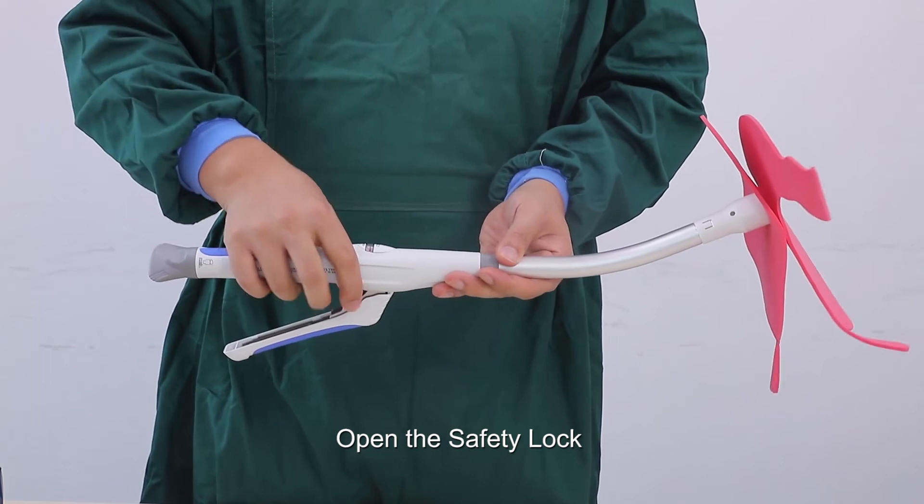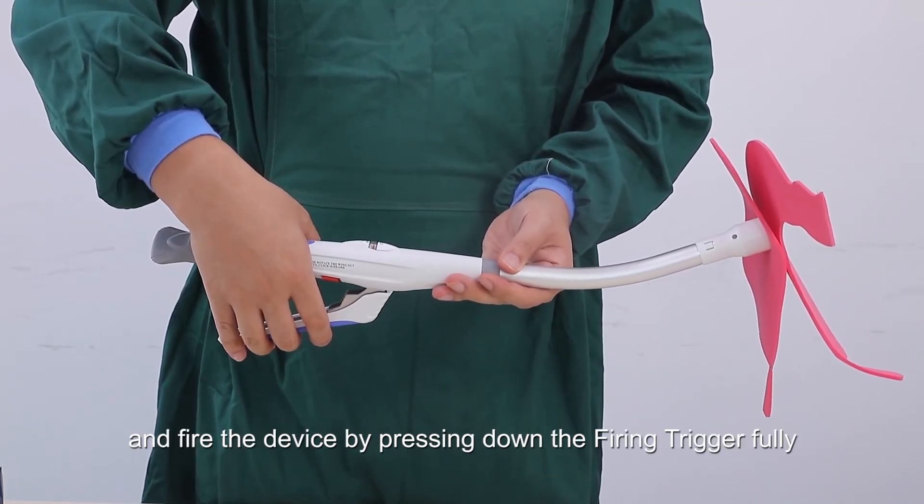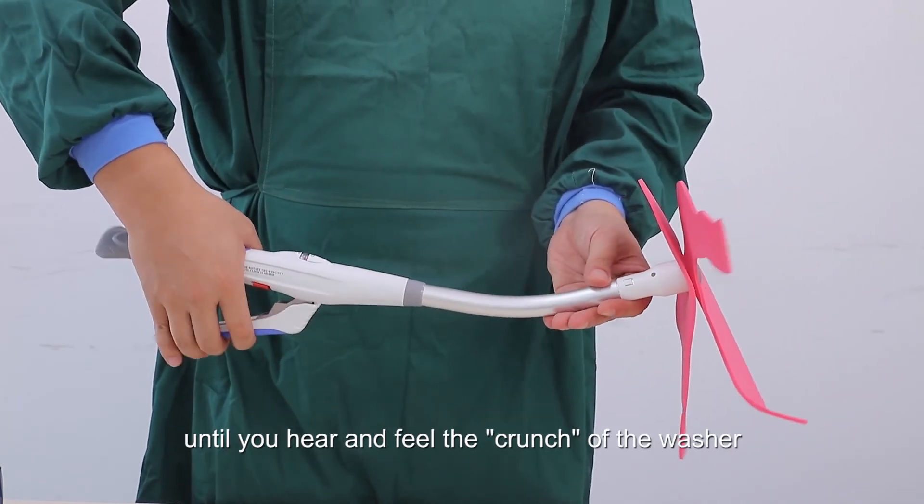It is recommended to wait 10 to 15 seconds before firing to ensure that any interstitial fluid is drained away from the tissue. Open the safety lock and fire the device by pressing the firing trigger fully until you hear and feel the crunch of the washer.